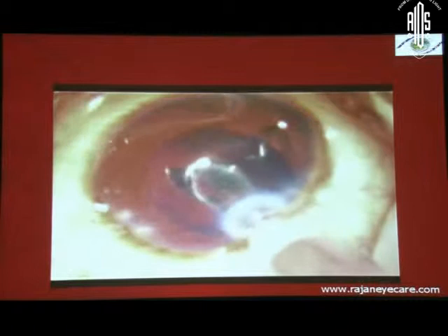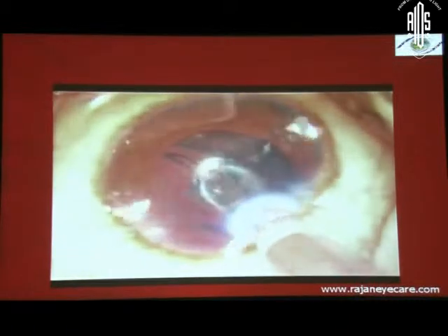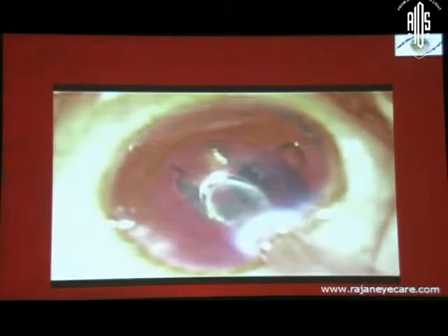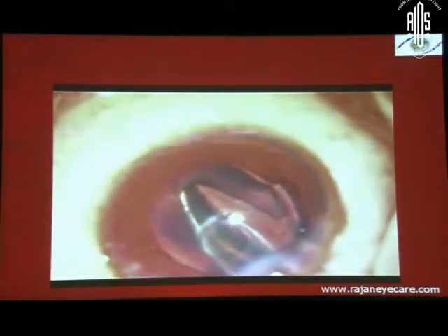Okay? Watch this video very carefully: a very nicely designed anterior capsulorhexis and a fairly okay posterior capsulorhexis, anterior vitrectomy done. Then she goes in and injects a hydrophilic acrylic lens in the bag. Everything is going on very well. See what has happened to the lens now. So much slack. And it goes through the capsulorhexis into the vitreous.